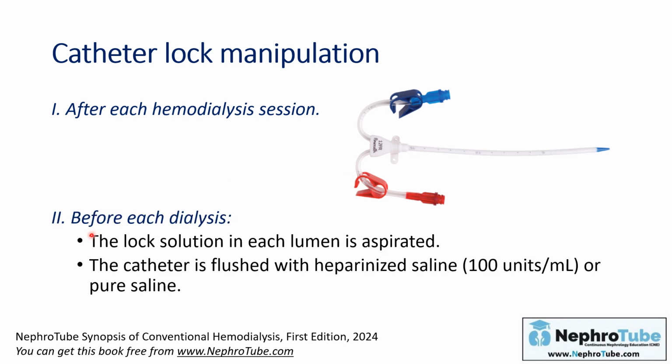Before each hemodialysis session, before starting hemodialysis, the lock in each lumen must be aspirated, and the catheter then flushed with heparinized saline or pure saline. Then you can start hemodialysis.